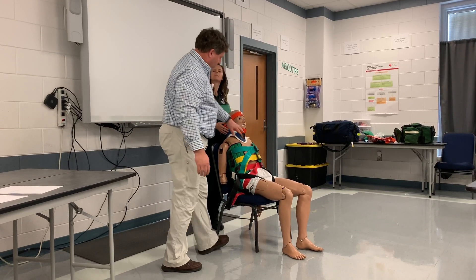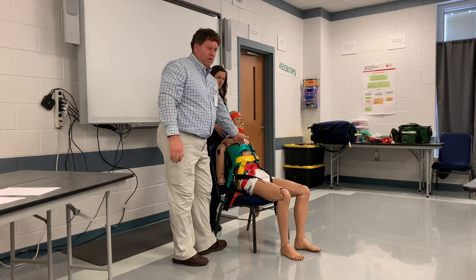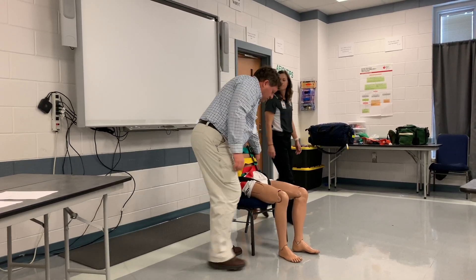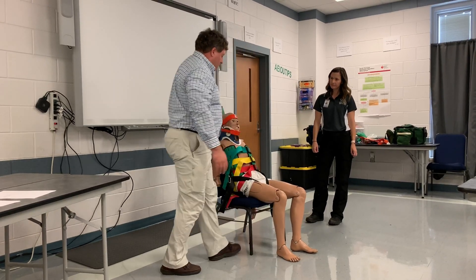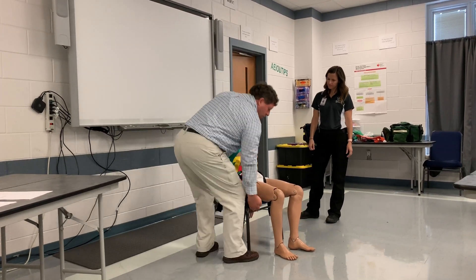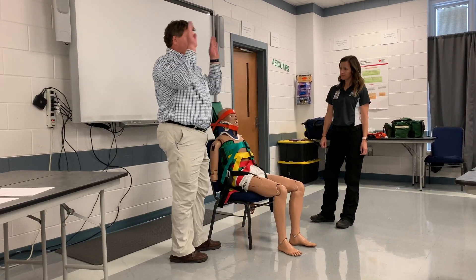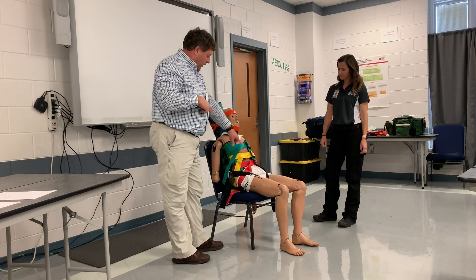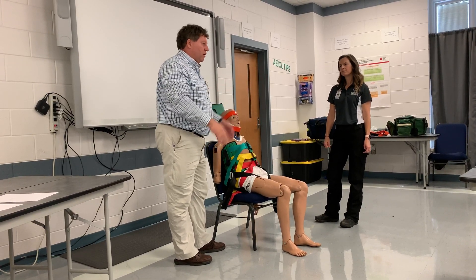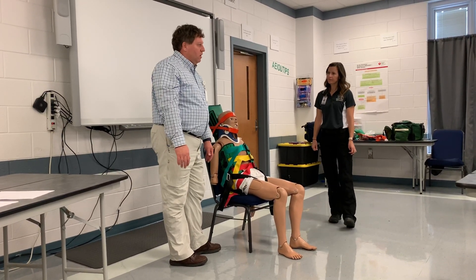At this point I still have to tighten up this top strap. Right before I move the patient, I'm going to snug this up a little bit - making sure I don't interfere with their breathing. His neck and back are now stabilized, so my partner can let go. I'm going to reassess my circulation sensory motor, all four extremities, and then we're going to move them to a board. On the side there is a strap at the handle - come here, underneath the leg, lift them out, put them on a board. The legs are strapped in place, so release those two white buckles for the legs when you get them on the board so the legs can lay flat. Then strap to the board, head locks, just like you normally would, and then reassess circulation sensory motor function. And that is your spinal immobilization seated position.